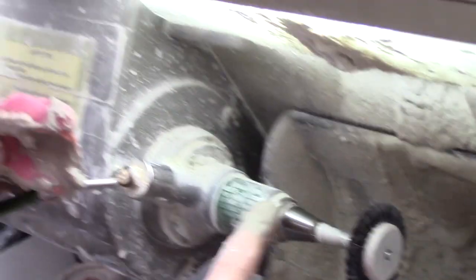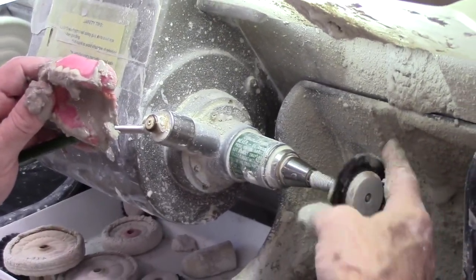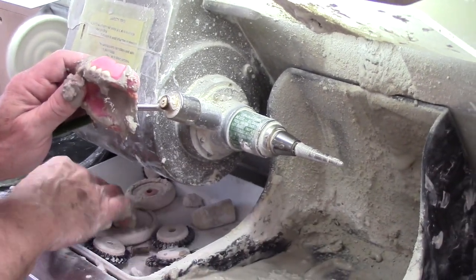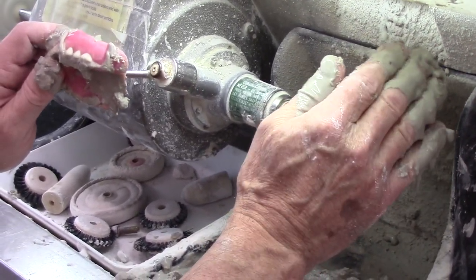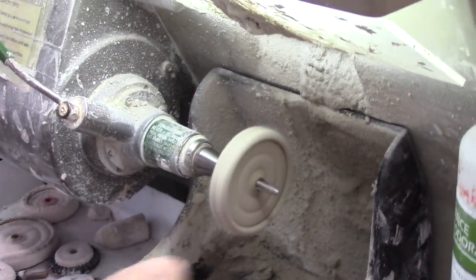Put it on here and it will stop — it doesn't shut the motor off, but it shuts the wheel off so we can unscrew the brush. Then I can put in the rag wheel. Put your hand up so it doesn't throw the water in your face, let the handle up, and now we're spinning again.